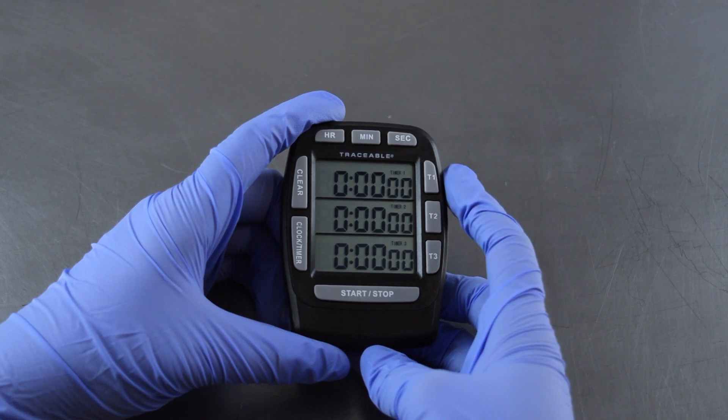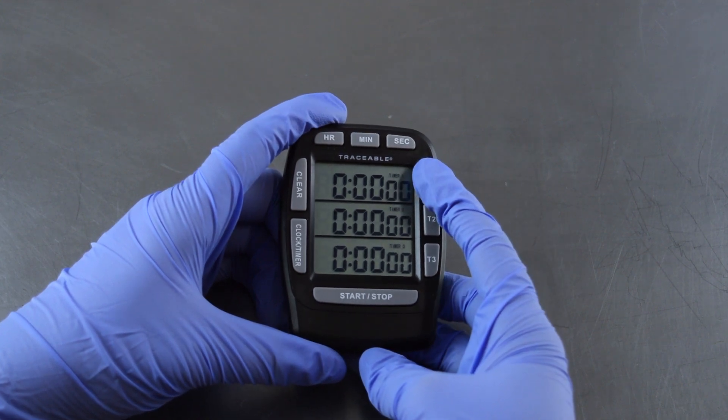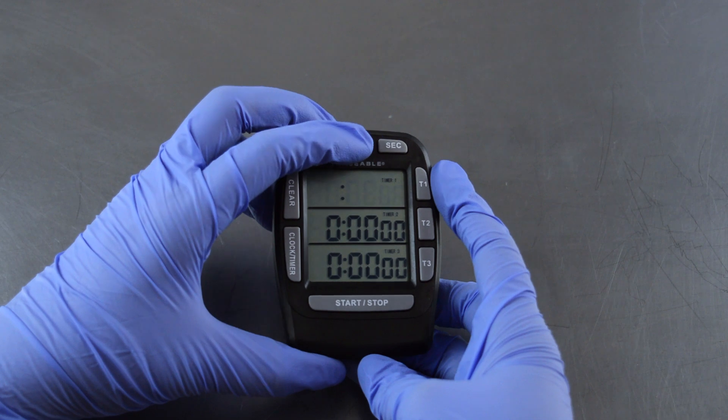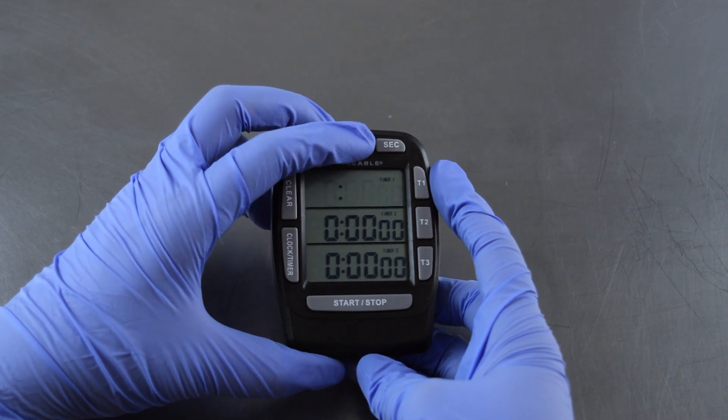If you're testing for microorganisms in your compressed air, you only need to use T1. Set for 10 minutes, and press T1 again to lock.